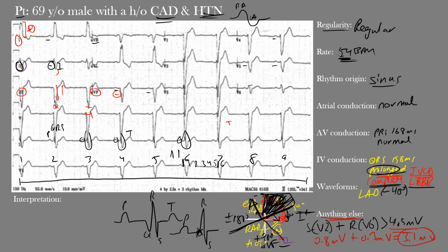Now notice in our normal heart, if we have our heart here and we put our right atrium and left atrium, right ventricle, left ventricle, and we have our leads that go across it. So the most anterior, V1 and V2, sit over the anterior portion of the chest, then V3, V4, V5, and V6 as we come this way. Again, not drawn to an anatomic scale, but these tend to overlie the left ventricle, meaning that the left ventricle is the biggest portion of the heart that has the most muscle, so it will actually have the most electrical pull. So we'll have our impulses that are strongest in that region.